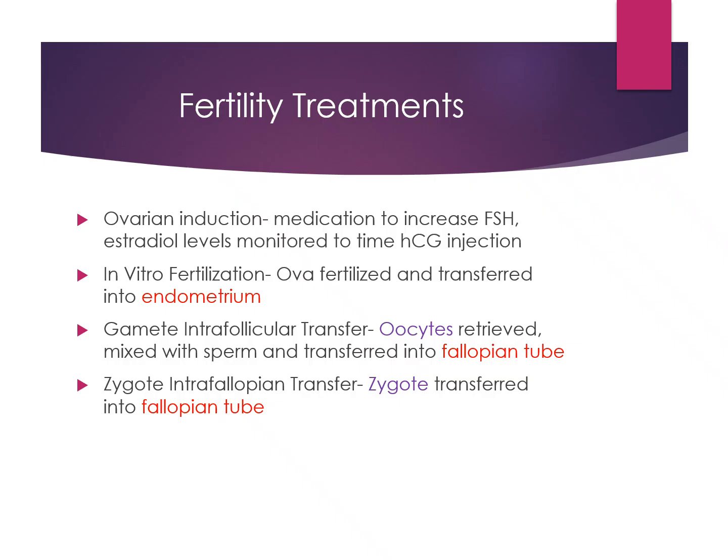So it's a very in-depth process. These women are getting scanned quite frequently. We're doing follicle counts on them. We're watching to see the growth happen before they're injected with HCG. So if you ever work in a fertility complex, then you will do a lot of follicular counts on the ovaries.